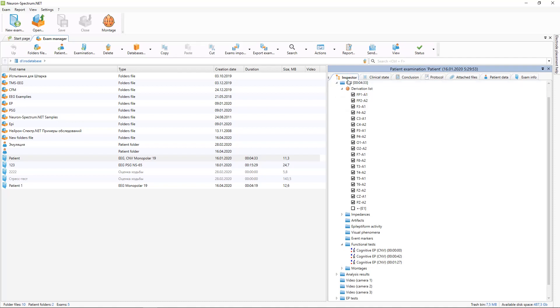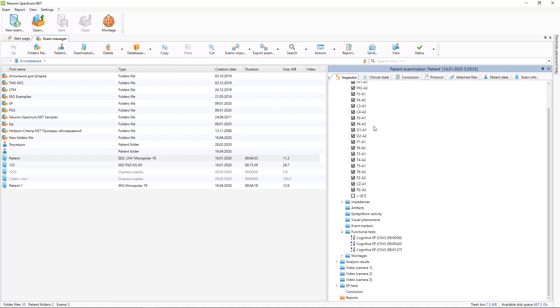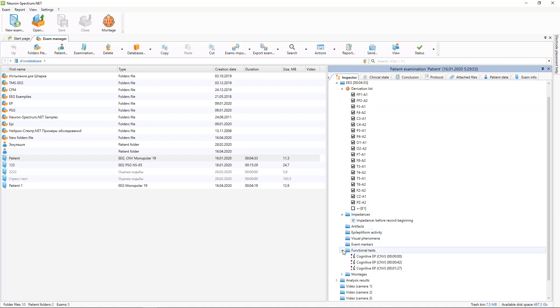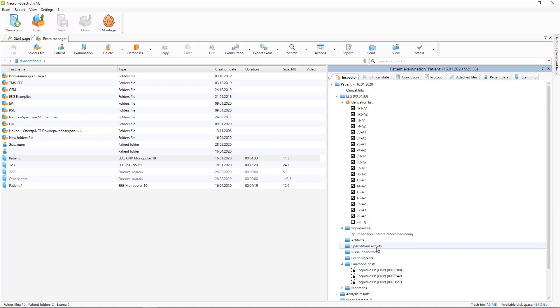Exam inspector shows you the derivations list, impedance measuring, and functional tests which were made during the examination.